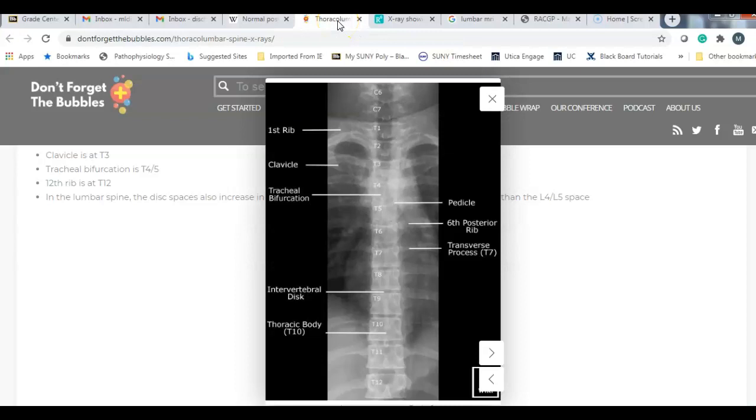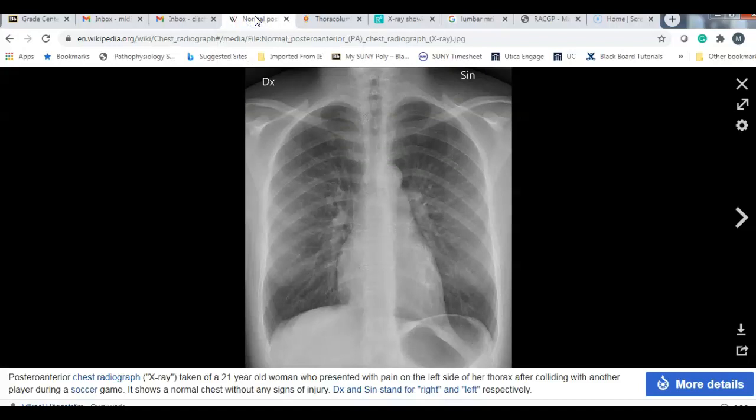You see how you can actually narrow down the x-ray field if you want to minimize x-ray exposure. X-ray exposure at this point, I mean, they're so fast. I think somebody told me you get more exposure to radiation flying than you do with x-rays, but you can narrow it down. I personally would rather see the whole field because once again, you're taking a chest film. What if that patient, God forbid, has some sort of tumor over here? You're doing it for the little bit of radiation, you may as well get the field.